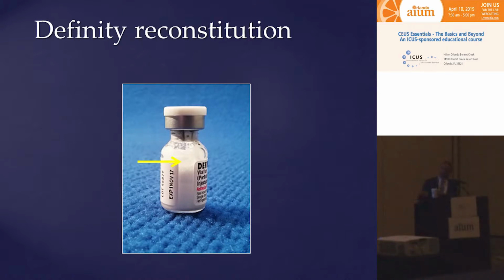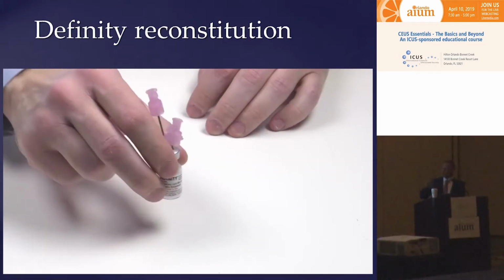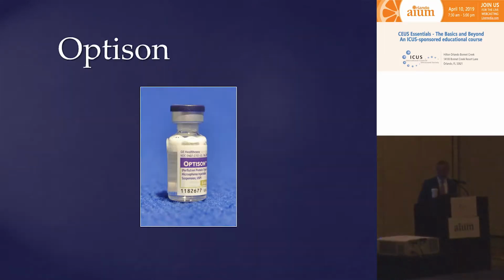Definity will also separate if you let it sit on the counter for too long. All you need to do with the vial, you again gently shake it, reconstituting contrast agent, and it will be ready for you to inject.